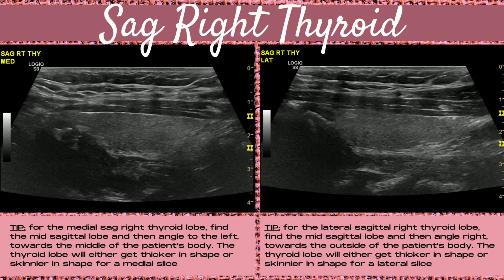Next, image the medial and lateral segments of the sagittal lobe. For the medial sagittal right thyroid, find the mid-sagittal lobe and then angle to the left towards the middle of the patient's body — the lobe will get either thicker or skinnier. For the lateral sagittal right thyroid, find the mid-sagittal lobe and angle right towards the outside of the patient's body. Everyone's lateral and medial slices are a little different, so there's variation in thickness. The important thing is to ensure you're angling the correct direction away from the midline.